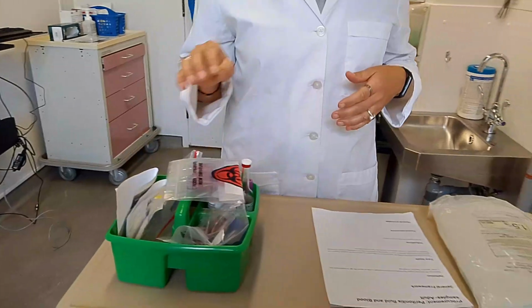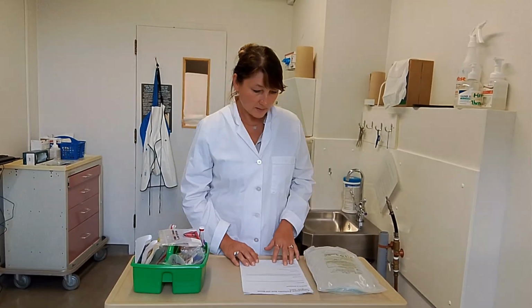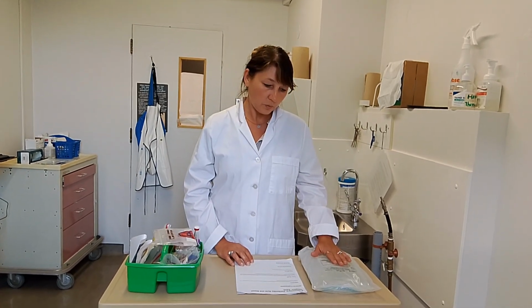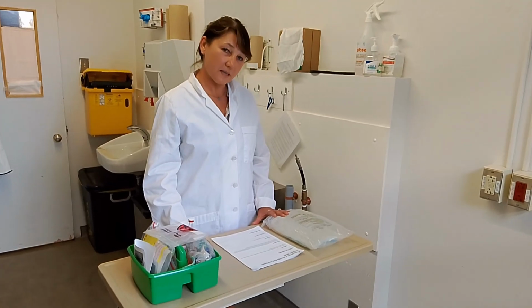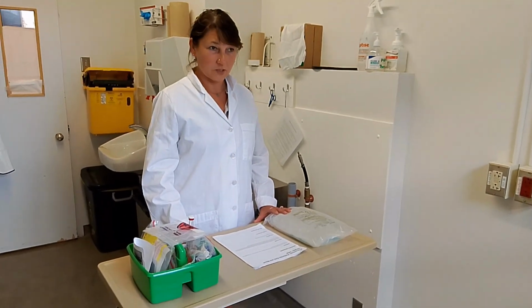Before you go to the floor, you will need to print your labels and take them to the floor or emergency room or wherever the patient is. You'll go on Oasis and order peritonitis protocol peritoneal fluid tests. Also, it's a good idea to bring a bag of peritoneal dialysate fluid with you in case the patient is empty. When you arrive at the patient's bedside, identify yourself and identify your patient.